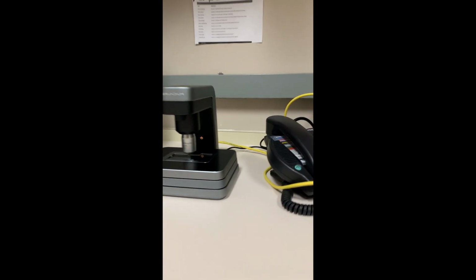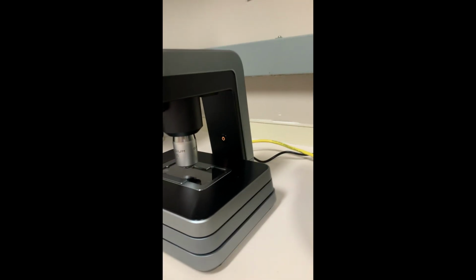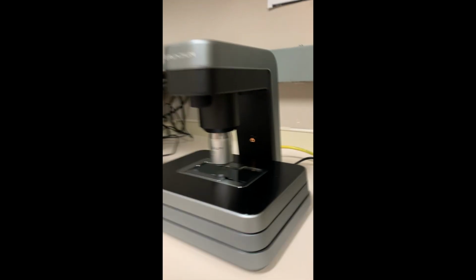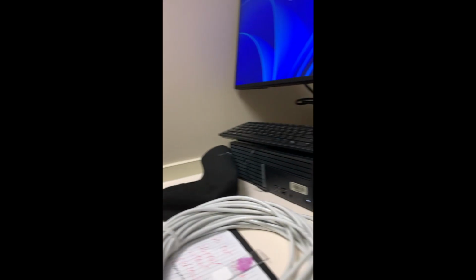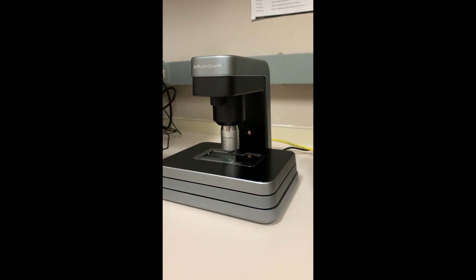Okay, so I am here and we just in our demo see, oh, it didn't connect. It says turn on the Grundium scanner, or ensure it is turned on. So you'll come here, see that the Grundium is uncovered, would have been covered when you got here, and there's a solid yellow light. What does that mean?